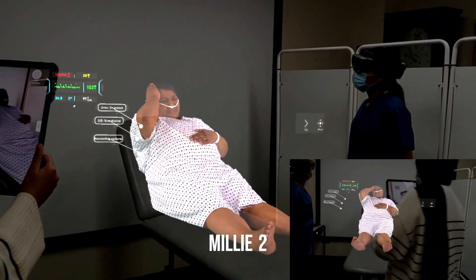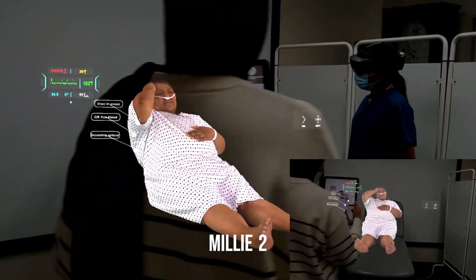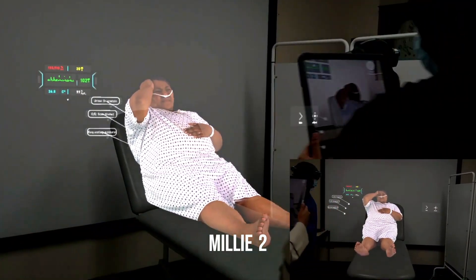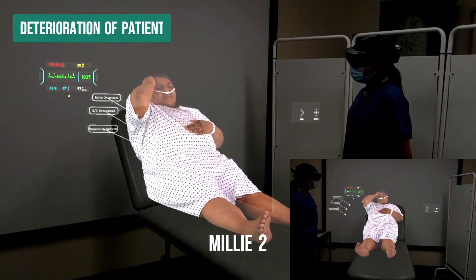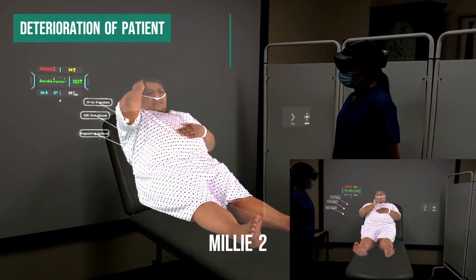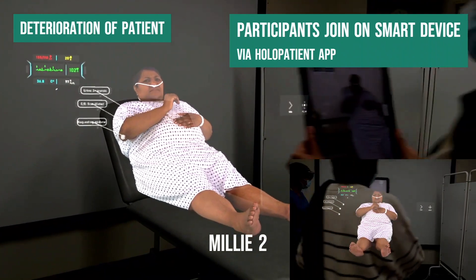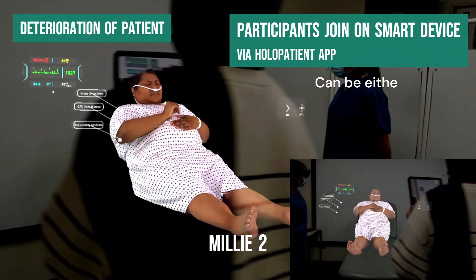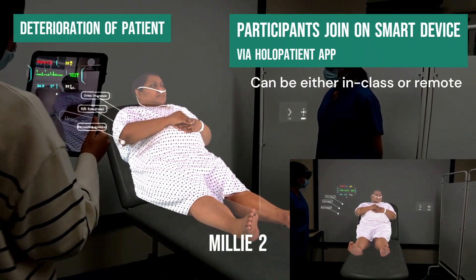The observations have worsened, and the teacher can change these prior to the teaching session. Users can join the session in person or remotely using several devices, including smartphones or iPads, or of course can wear the HoloLens headset.